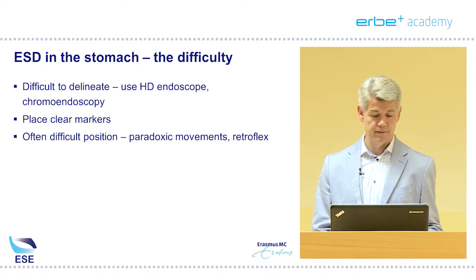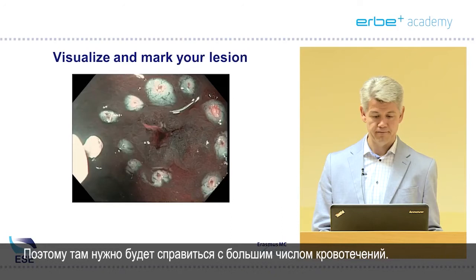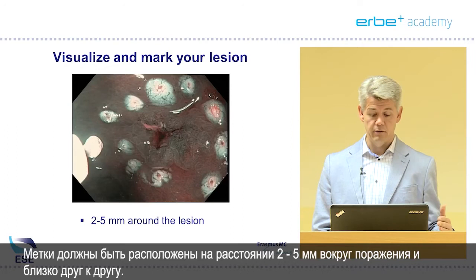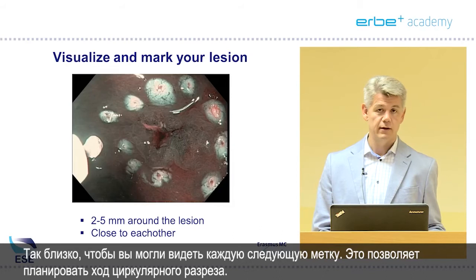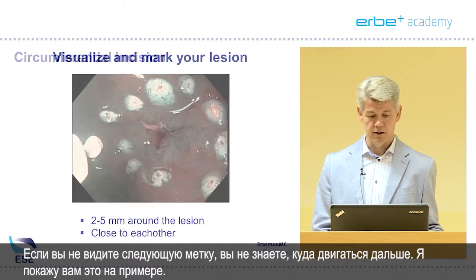If you find yourself in a different situation than where you started, make sure you get rid of most of the air before you continue. In the body of the stomach you'll find lots of submucosal vessels — a lot more than in the antrum — so you'll treat a lot of bleedings there. Markers should be placed 2 to 5 millimeters around the lesion and close to each other. You should be able to see from the first marker to the next so you can plan your circumferential resection. If you cannot see the next one, you have no way of knowing where to go.